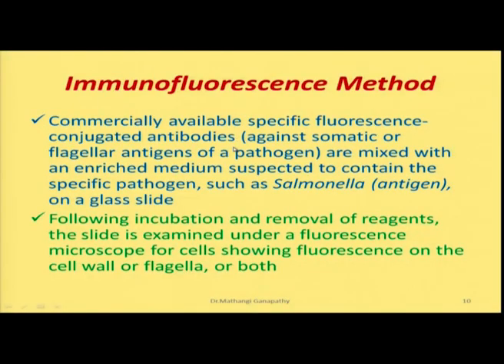Now, for the detection of a particular pathogen, we will commercially raise antibodies, most probably against either some cell wall components or the flagellar materials of the pathogen concerned. So, these fluorescence conjugated antibodies would be mixed with the enriched medium. Now, following incubation and the removal of reagents, you can examine the microscopic slide under a fluorescence microscope, showing the cells showing fluorescence on the cell wall or the flagella or both.